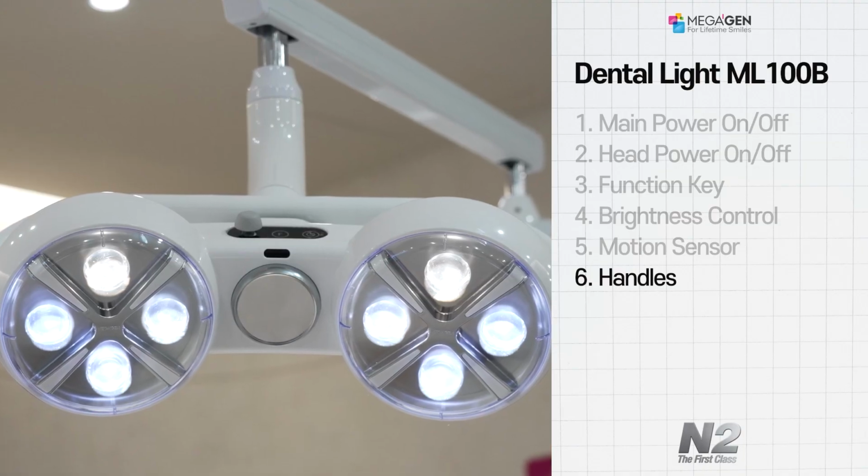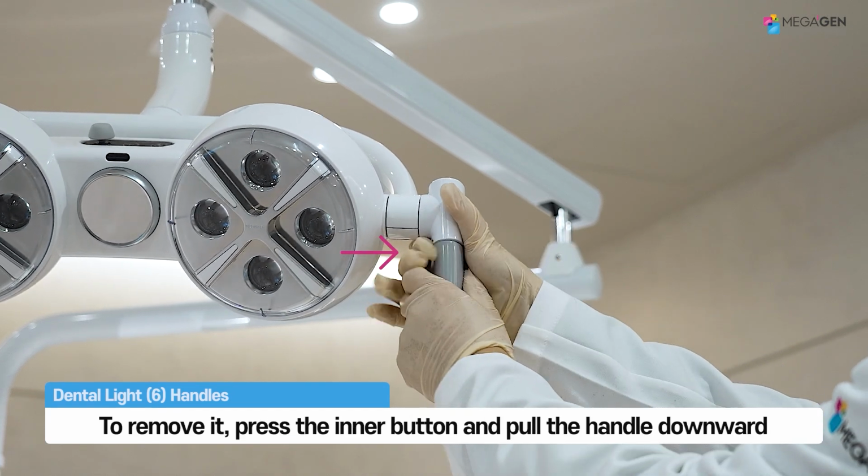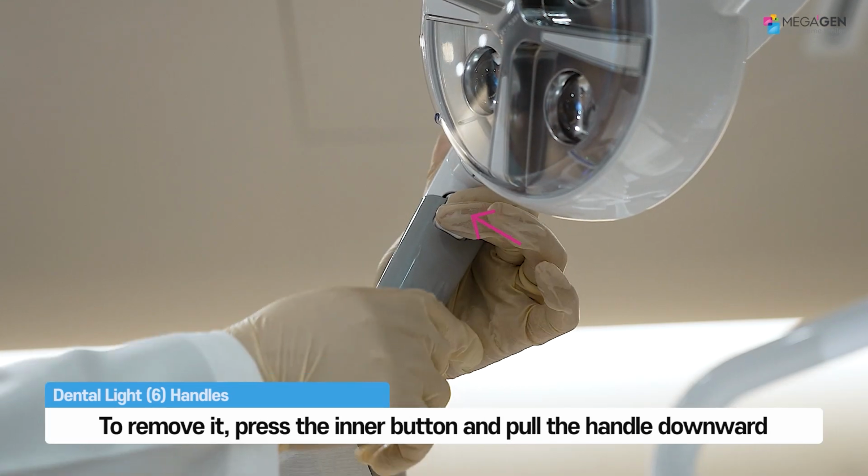Detachable light handle. The light handle can be detached for sterilization. To remove it, press the inner button and pull the handle downward.